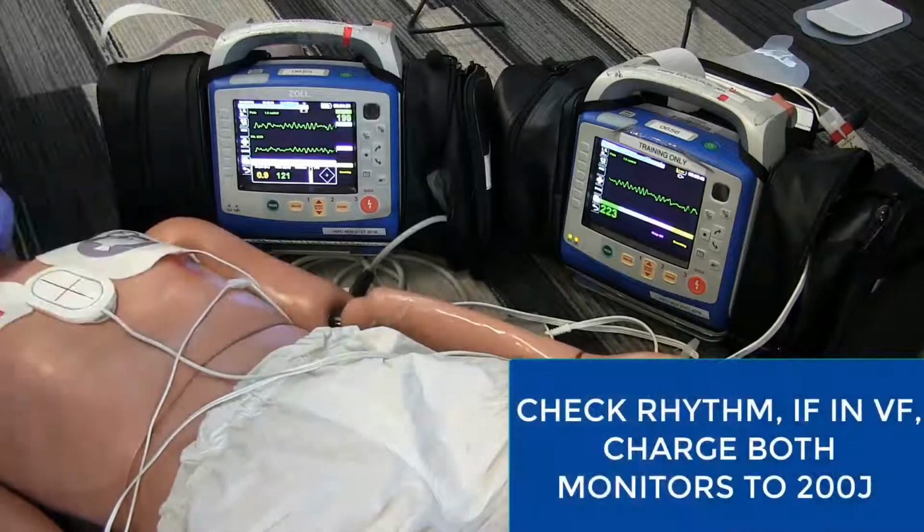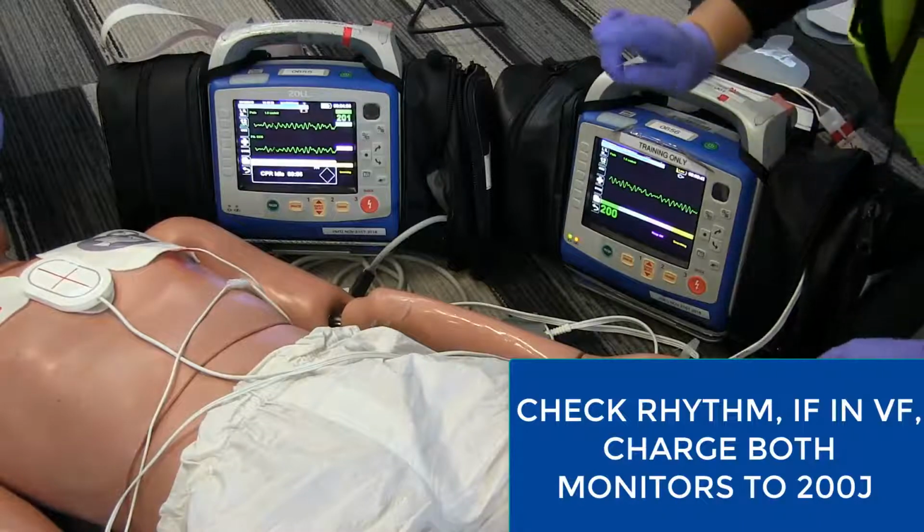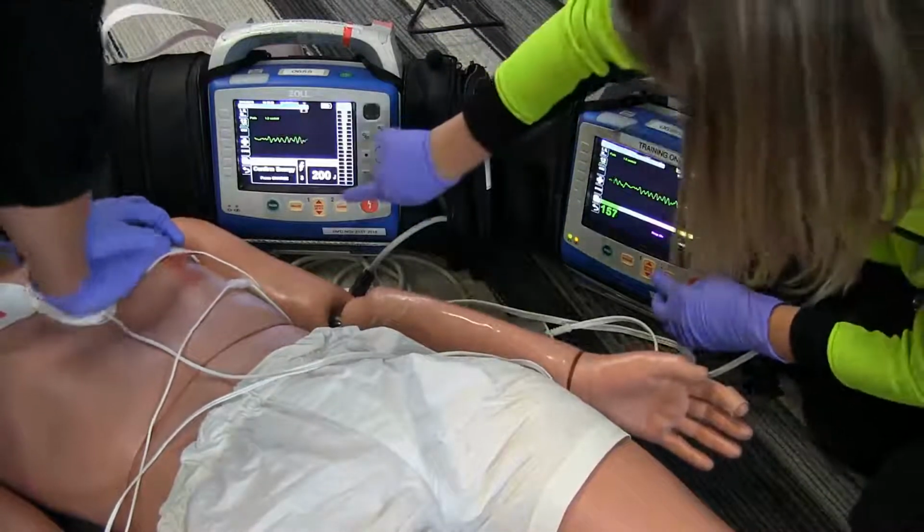Okay, stop CPR. Let's analyze. The patient is still in VF. The first double sequential is going to be done. Continue CPR. Charge both monitors to 200.